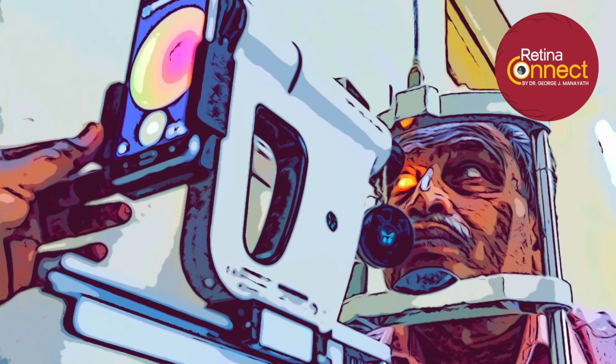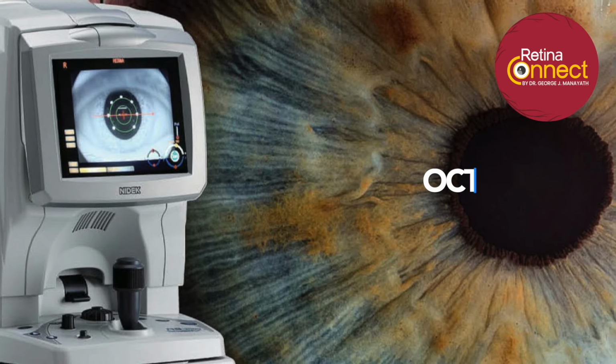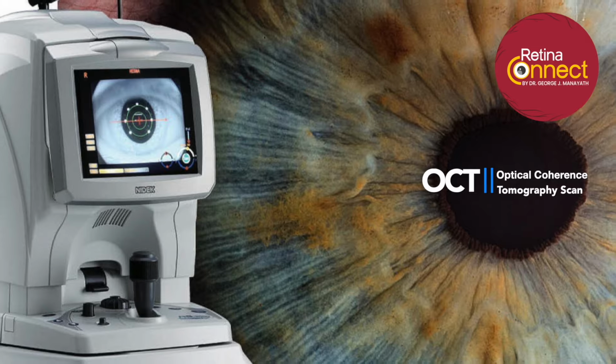So there are simple tests, the retinal imaging tests that are non-invasive, without side effect or any discomfort to the eye, which can be repeated each visit that you make to the retinal specialist. For example, the most common test currently done is OCT or Optical Coherence Tomography scan.